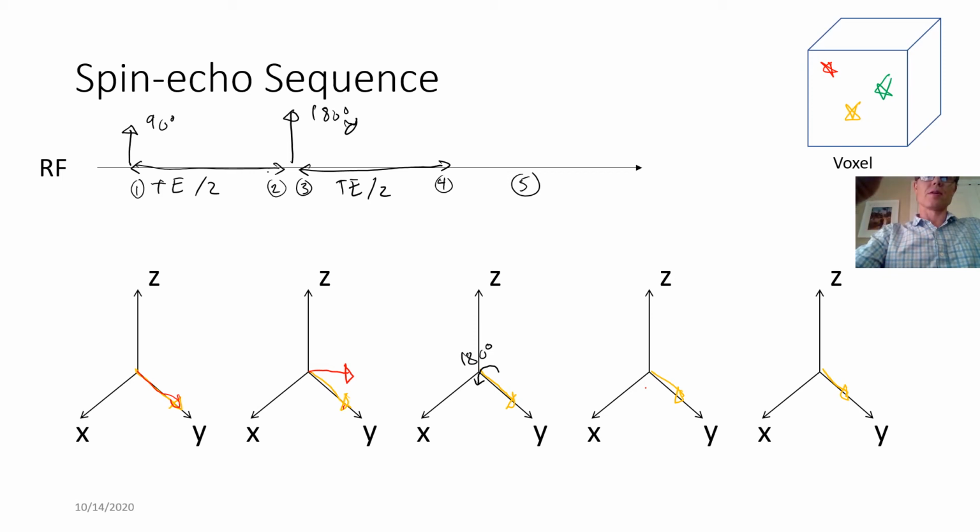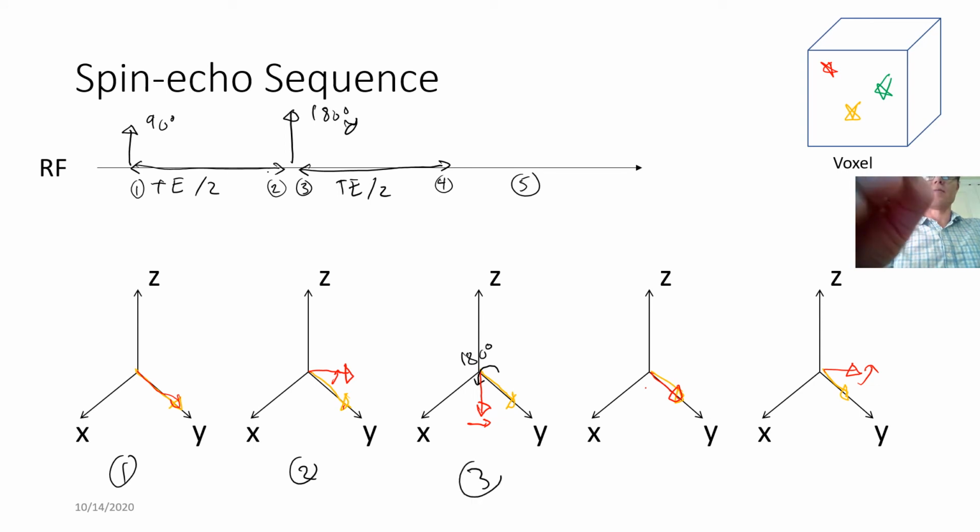And I think this drawing is a little bit easier to visualize this 180 degree flip, but it's going to continue rotating in the same direction even before and after this flip. So here, looking at these different times during the pulse sequence.